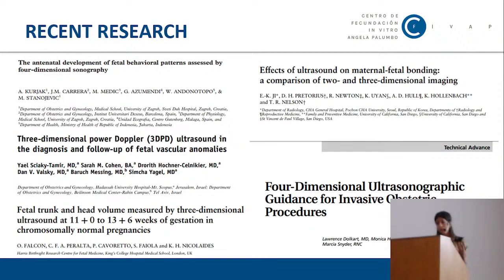The advantages of this 3D and 4D ultrasound are obvious, but the use of this tool is still under close research evaluation in certain areas, such as fetal behavior. Multicentric studies of fetal brain function have been carried out, the aim of which was to establish the standards of fetal body movements and facial expression as a diagnostic criteria for brain impairment.